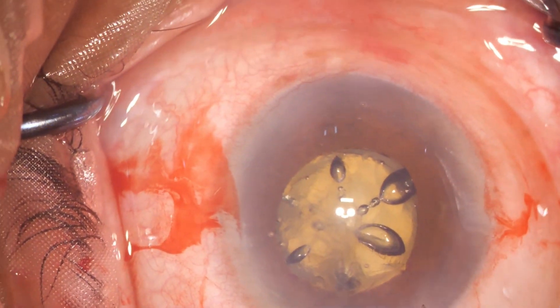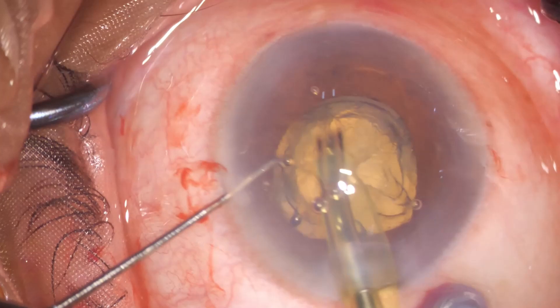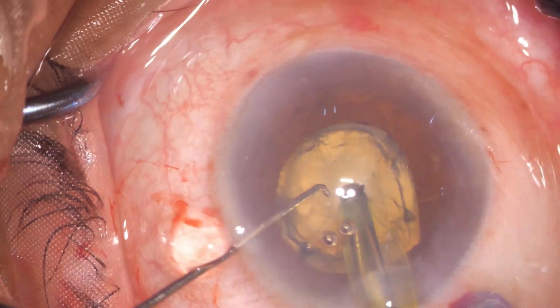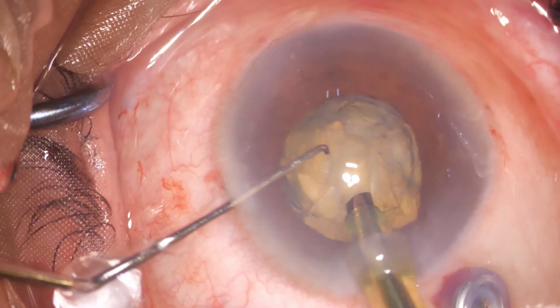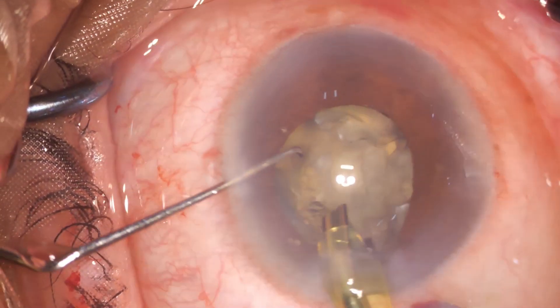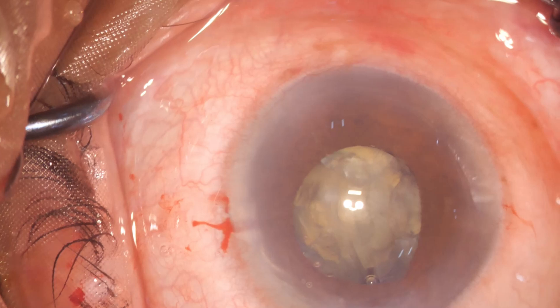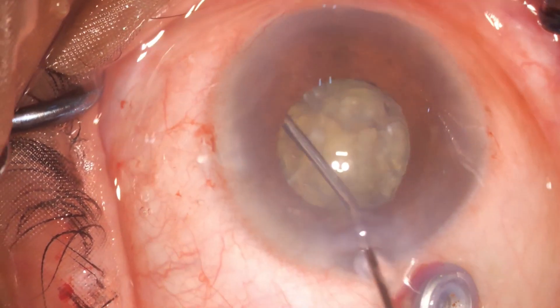We must realize that this patient has a 1.6mm AC depth and an overall eye axial length of just 16 millimeters. The cataract is done routinely — it's just that the space to move the pieces around is really, really small.